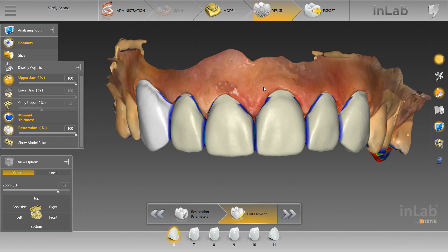Now prior to receiving this case, this dentist sent me a pre-op scan. I virtually prepped that, made a wax up for it, and printed the wax up and sent it to the dentist. The wax up was used for temps and also for the biocopy. And what you're looking at right now is the biocopy of the wax up.